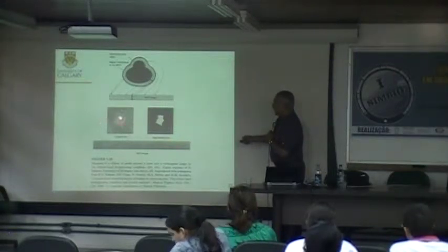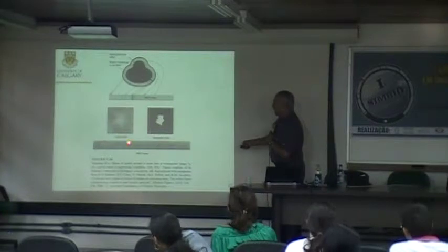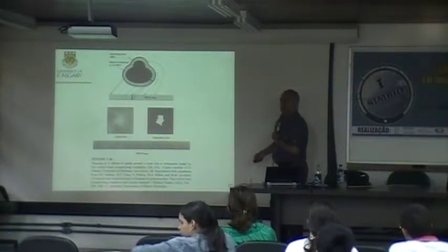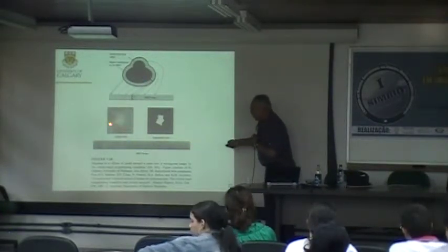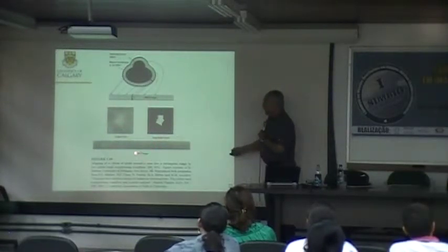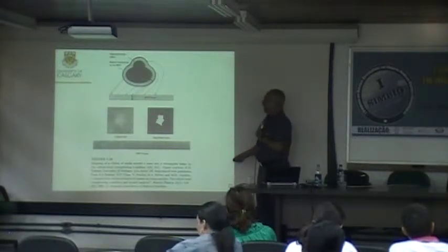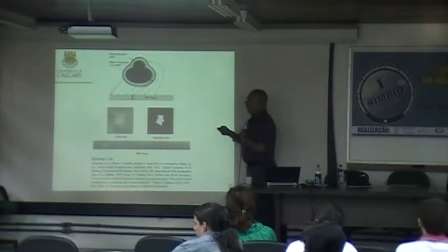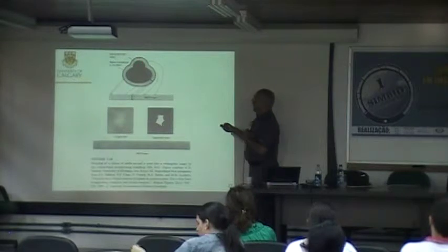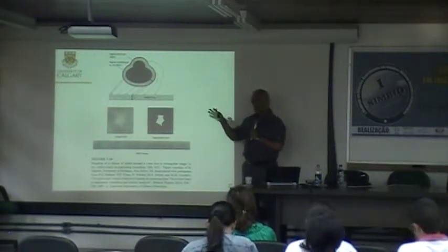So this is a tumor, this is the segmented region. They took the ribbon and made it straight, rectangle. So when there is a spicule here like this, you will see a line here. And they did texture analysis using this. Essentially, similar to what we are doing in that a ribbon is used. How the ribbon is defined and how it is used are a little different.